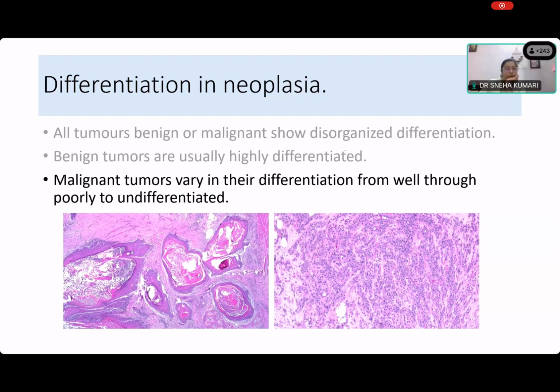On the left side, we can see squamous cell carcinoma with keratin. All right, very good. So it's an invasive squamous carcinoma, and you would say that it's producing keratin. Yes, and keratin pearls. You're absolutely right, Sneha. So this is well differentiated. Now on the right-hand side, what do you think, Navneet? Poorly differentiated, as it's a carcinoma.